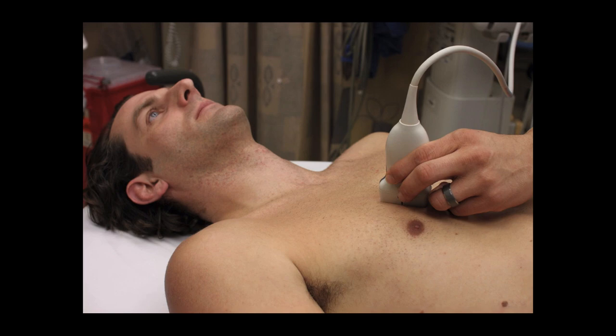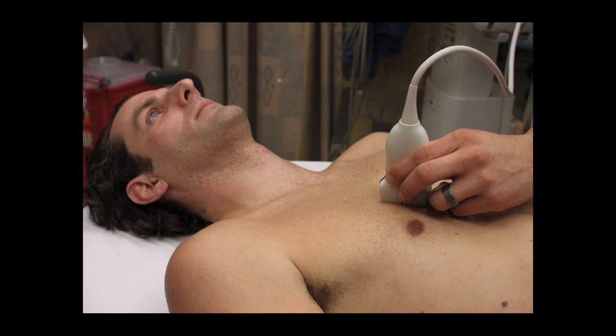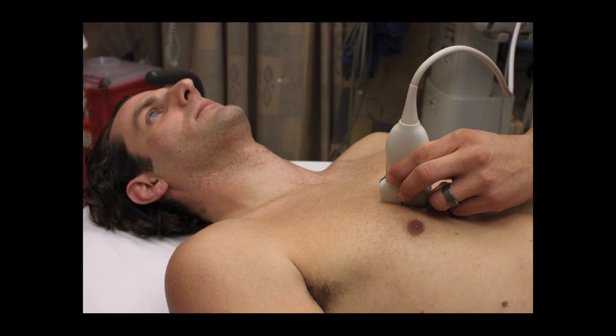As far as where to actually place the probe on the patient, a lot of sources say to place the probe between the second and fourth rib space. I would suggest going a little bit lower, maybe between the fifth and eighth rib spaces. The reason for this is basically just anatomy. If you have a supine patient, air is going to layer more anterior, and the way the chest wall builds more anterior is going to be a little bit lower on the patient — closer to the feet than the second and fourth rib spaces. So I'd start around five to eight.